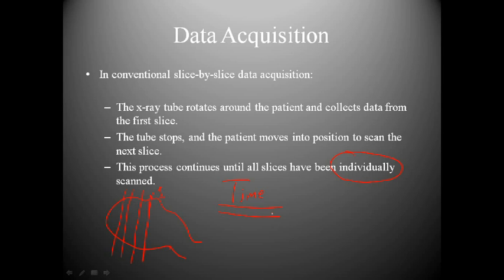And the problem with slice-by-slice is that when you go to recon it, you have these little things like this. Not like this.